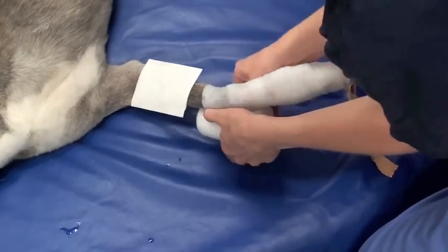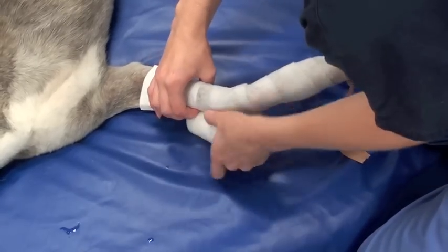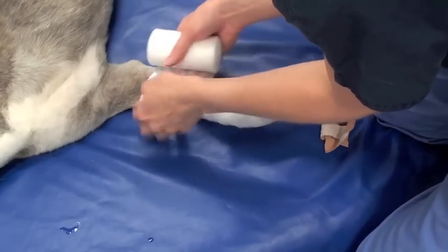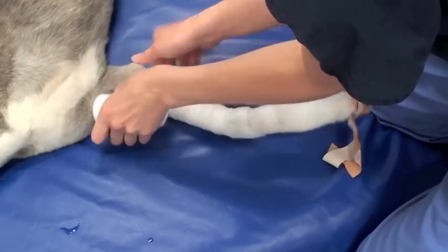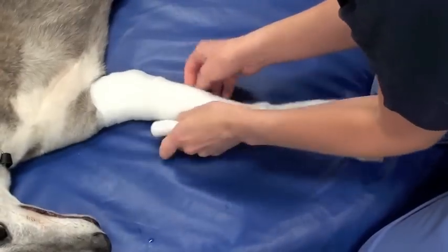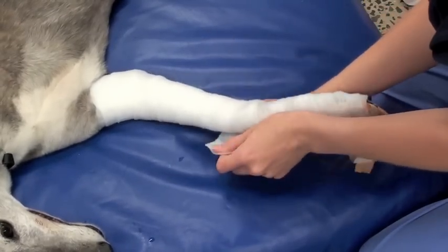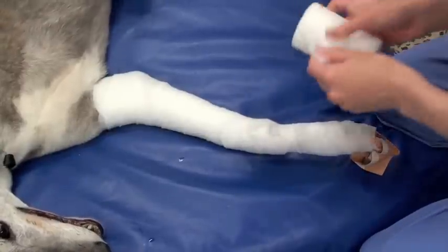The next layer is to place cast padding over the leg, and the most important thing here is to put lots of cast padding. Putting lots of cast padding is what keeps the bandage from bunching up and sliding down off the leg. You can use a standard cast padding product or roll cotton, and again the key is to put a lot of cast padding on there — that's what's going to keep the bandage staying up.